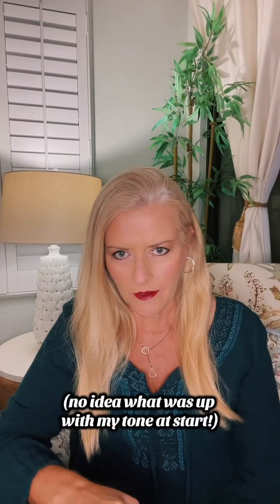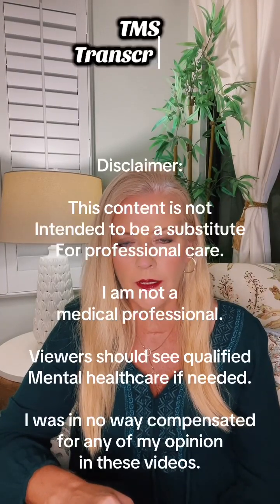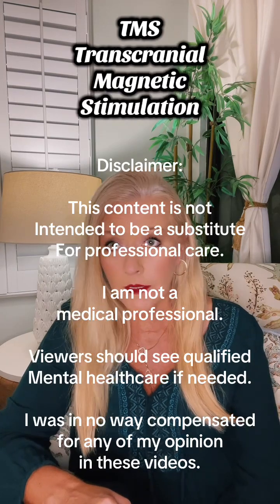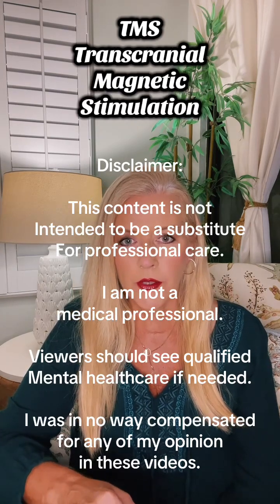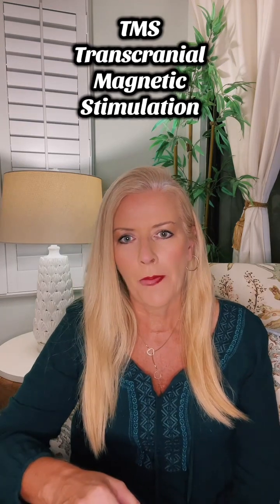Good evening. I'm here on day 4 of my TMS journey. I started on Monday. Today's Thursday. Monday was a mapping day and one session. The last 3 days have been 2 sessions with 50 minutes in between. Each of my sessions is 3 minutes long because it is a Brainsway deep TMS treatment.